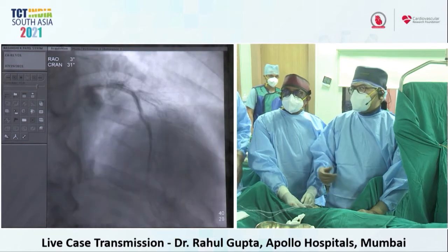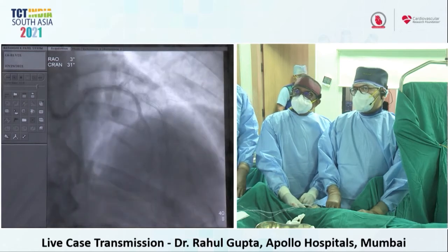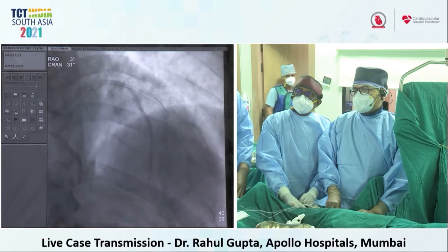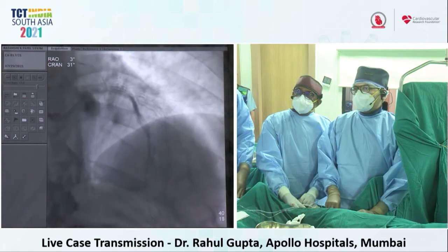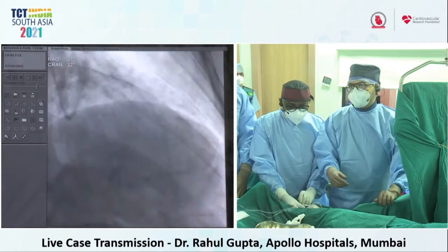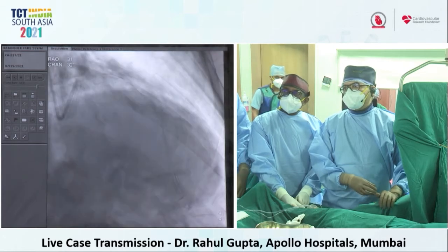Okay, thank you Rahul for effectively demonstrating the railway catheter system. All 7 French can take in the radial artery. Anyway, here the diagonal and LAD were occluded before. Even if you have some suboptimal result in the diagonal, it looks okay, but the diagonal doesn't seem to be flowing as good as the LAD, but many times we tend to accept it as long as the flow is maintained. But it looks like a TIMI 1-2 flow in the diagonal. Probably if needed, you can work on it. We'll allow you to work in peace, and thank you for the effective demonstration.